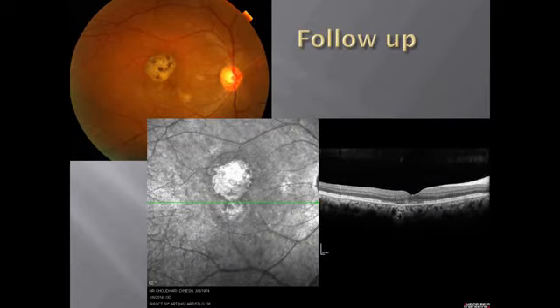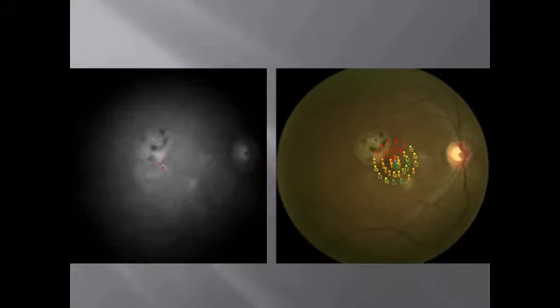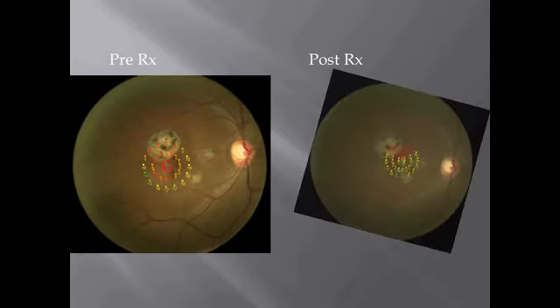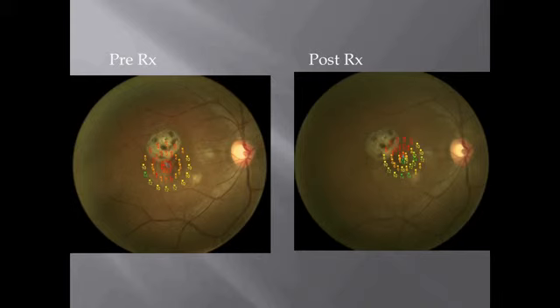And then this is after the injections you give, and you flatten that area, and then when you pass the scan, that lower reddish area tends to become green comparatively. So these are the pre and the post treatment, and now you can compare exactly how these spots are changing in relation to the microperimetry which is done.